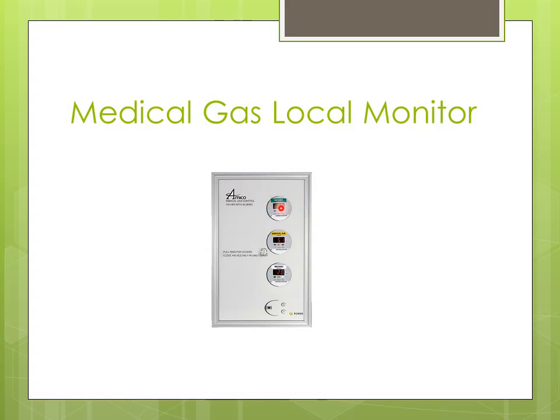Each one of these will have the amount of pressure, and they will alarm if those pressures go out of range. And these are typically, again, located outside of rooms. Sometimes they might be inside of rooms. But it's important to know too that if they're going to be located in the room, there's going to have to be valves outside the room as well. Typically these are all located outside the room.